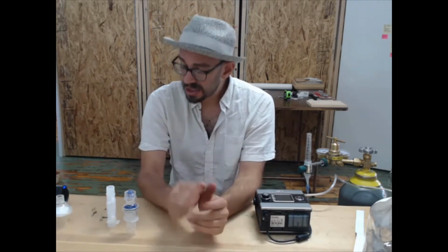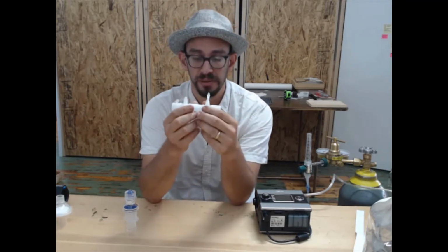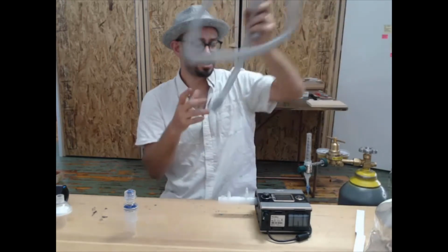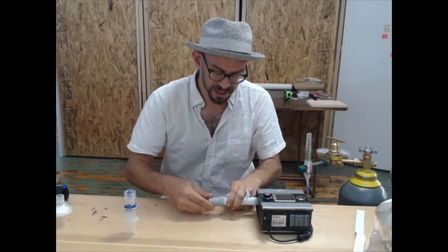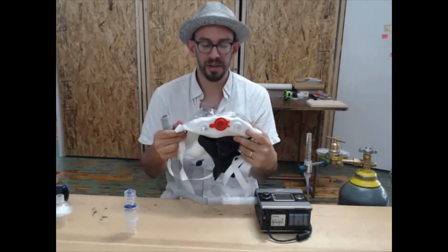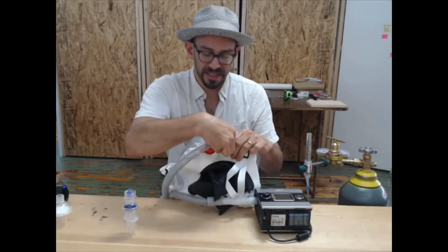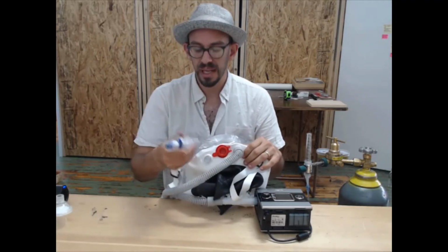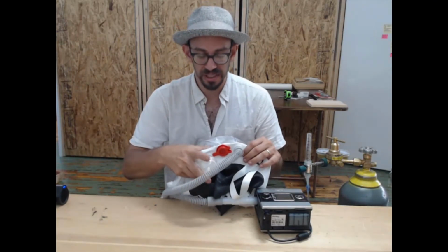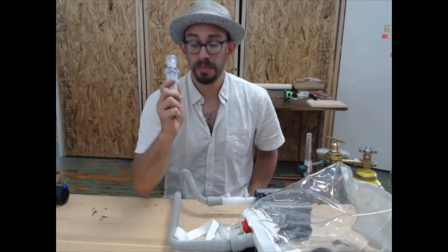Now, let's go back and look at how to assemble this circuit. The first thing we're going to do is take the two oxygen enrichment adapters, connect them, and go ahead and plug those in. 22 millimeter hose, connect, and you'll see on the helmet there are two ports. You can use either one. Go ahead and connect it, and then finally the 22 millimeter viral filter goes on the expiratory side. You'll notice the one thing I did not connect is the PEEP valve.